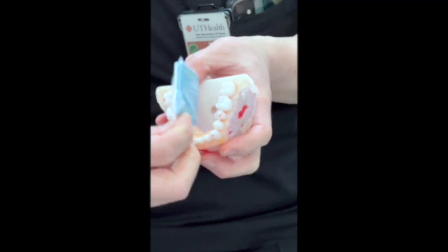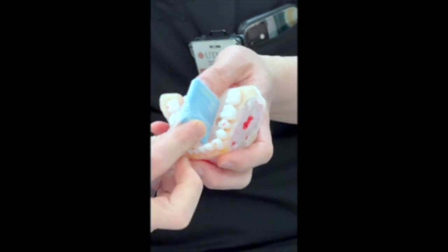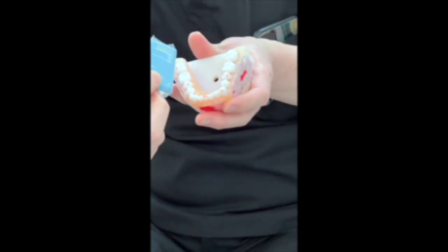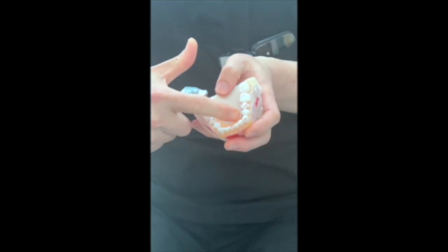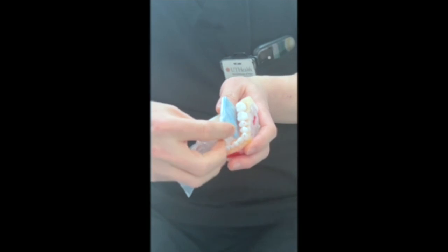You can't just push the tongue down. You need to identify where the tongue is and identify the lingual space, and then place it correctly into the lingual space.